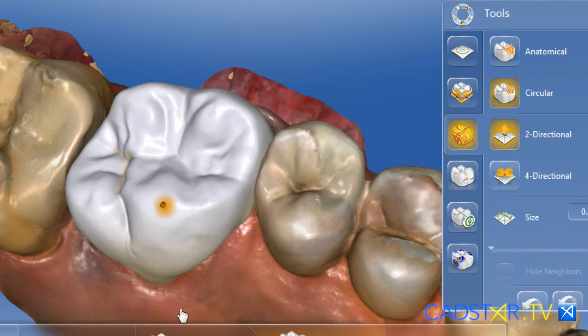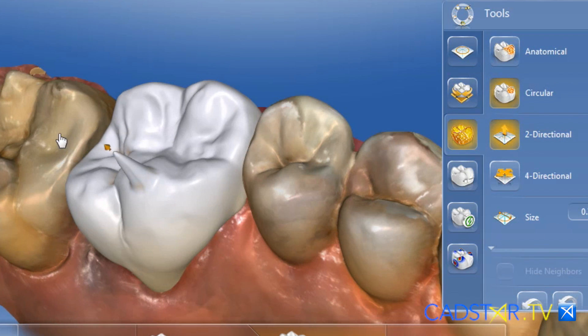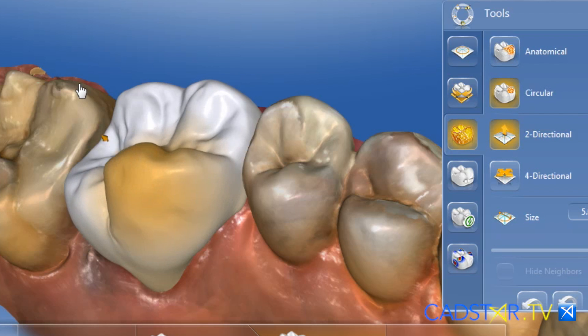You love them both. My favorite, though, is the circular shape tool — the two-directional circular shape tool. I have the ability to use a paintbrush size, either large or small, and move wax around without losing the morphology. The beautiful morphology provided by the CEREC software — I want to retain that. I don't want to smooth it away.